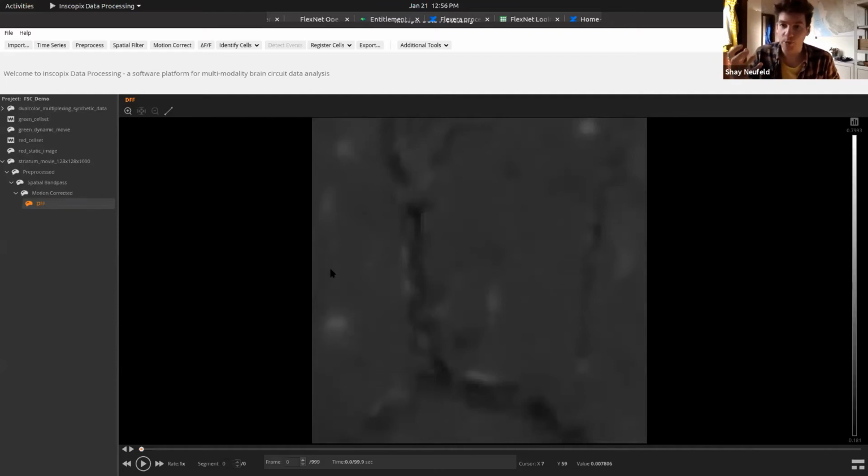Because there are other places in the app that are drawing things on the image, and that can create collisions with the line measurement tool, it's not available if you're clicked in every specific module. It might not be available, so you'll see it grayed out. If that's the case, you just need to cancel out of that module and it'll have access to it again. We just did that to simplify our lives a little bit. Otherwise, it was going to get some messy collisions between the line tool and the contours tool, for example.